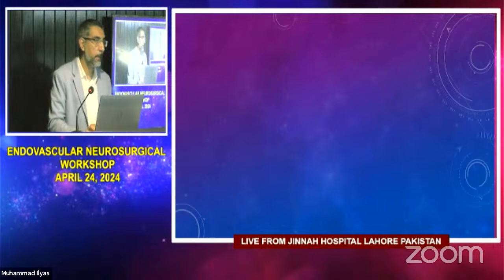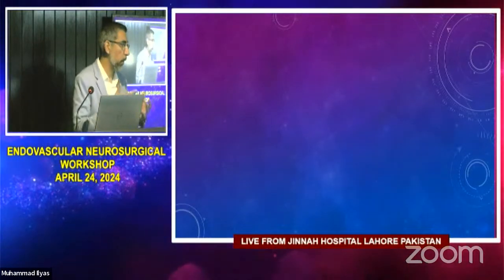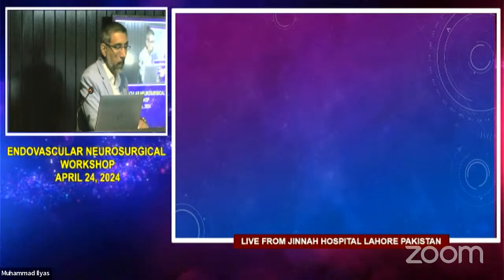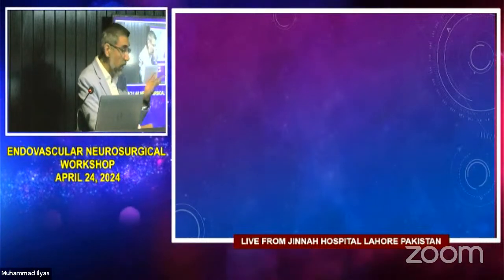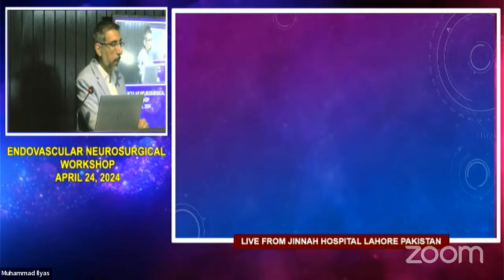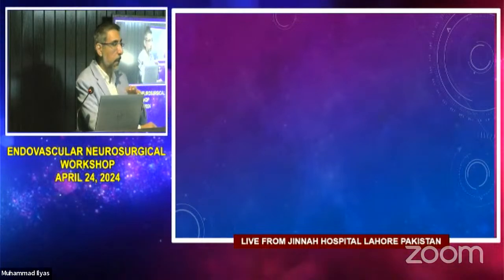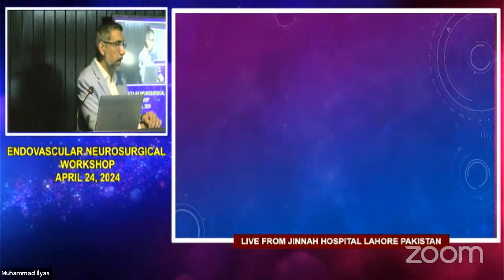So in a direct CCF, you have a hole in the artery, and it's a big enough hole, and the blood is pouring out into the cavernous sinus. They're losing vision. The blood's getting out into the superior ophthalmic vein. So yeah, so we try to do transarterial, transvenous. Some people would put like a bunch of coils in the cavernous sinus, and now more recently we have started putting Pipeline devices, because then hopefully it will cure.